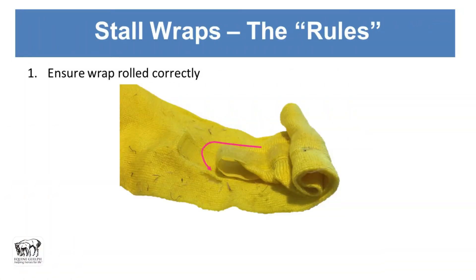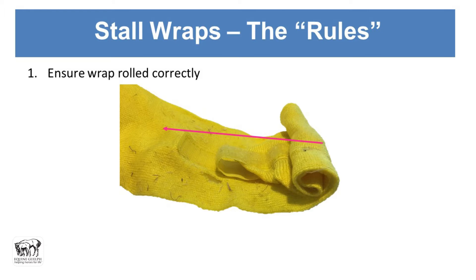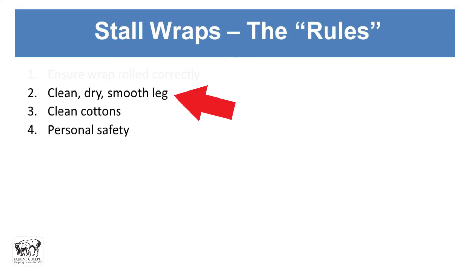We always want to ensure that the bandage is rolled correctly. The easiest way is to make the velcro meet and then keep rolling in that direction so the velcro stays hidden in the middle of the bandage. You want the leg to be dry and clean, because wrapping dirt in can cause pressure sores that lead to wounds. The hair should be smooth for the same reason, and cottons must be clean — dirty cottons cause the same problems as dirt on the leg itself.